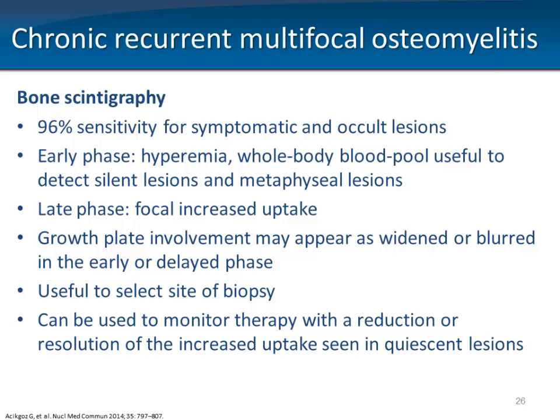Growth plate involvement may appear as widened or blurred in the initial or late phase imaging, and the technique can be useful to select the site of biopsy, and you can also monitor treatment, as you would expect that these lesions decrease during therapy.